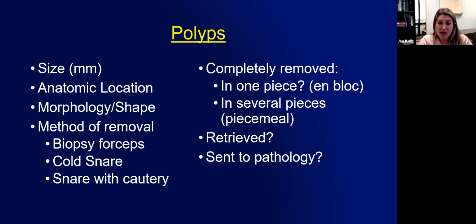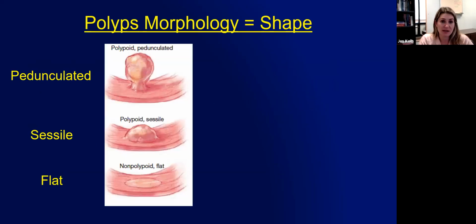So what kind of different polyp types are there? Well, if we're just describing the morphology or what they look like, we typically think of polyps as either pedunculated. Pedunculated is kind of like a tree. It's polypoid, sort of on a stalk, and I'll show you some real examples. This is just a cartoon. Sessile is more flat, but with a little bit of height to it.